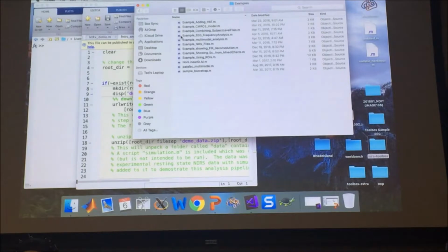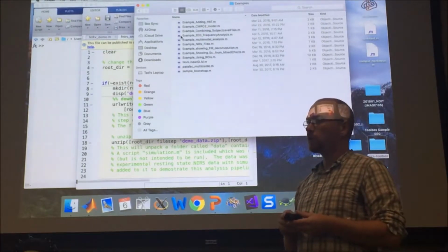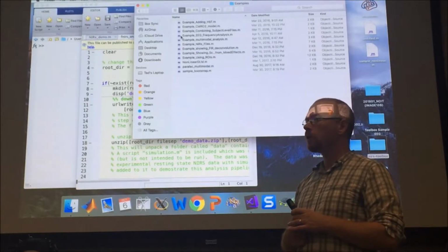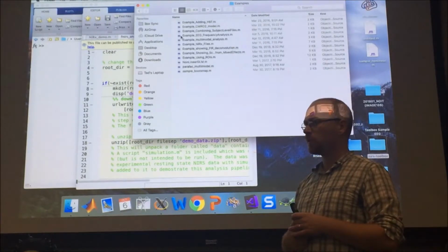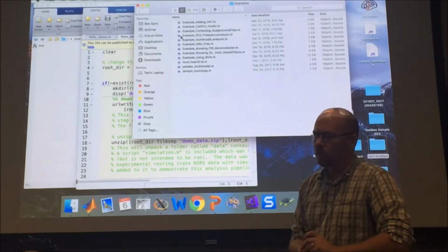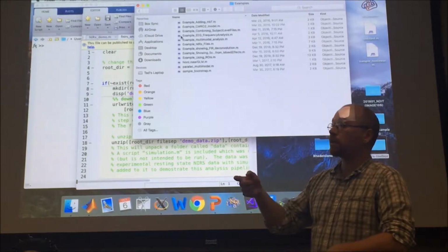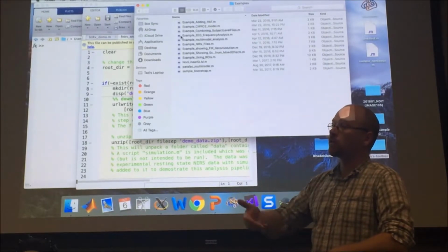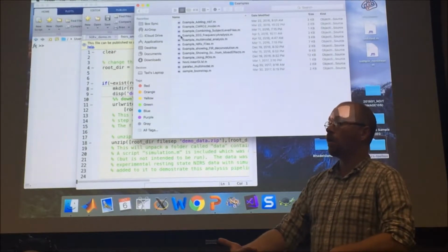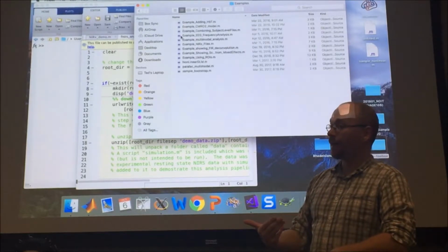With Granger causality, you're doing connectivity analysis? We are. We've started to move into the multivariate Granger analysis to do the connectivity analysis. We have a paper that came out this year. Everything I talked about before lunch, fixing serial correlations and outliers in the context of the general linear model, actually turns out to be even more important if you start to talk about connectivity.